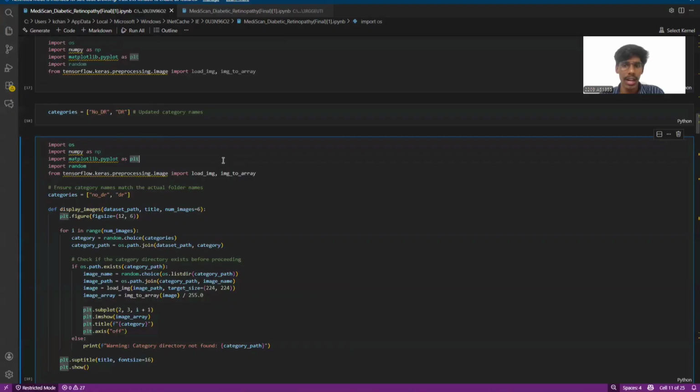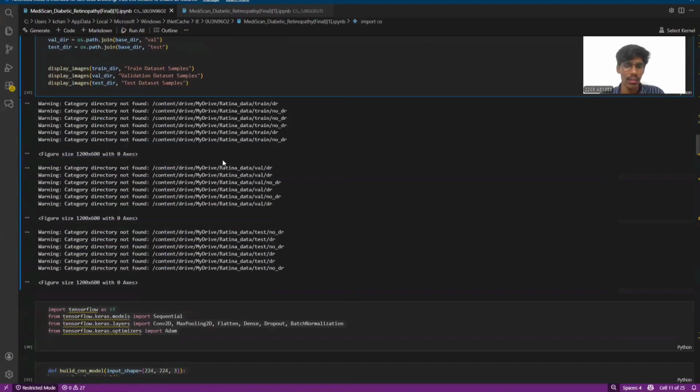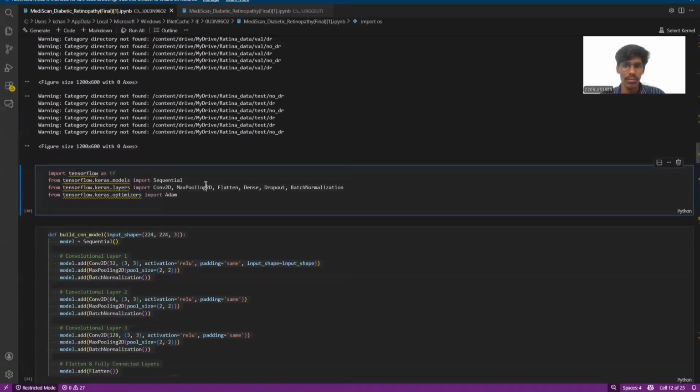Here, a function randomly selects, processes, and plots six images from your DR and no DR categories. It then executes this function for your training, validation, and test sets to provide a visual quality check of your dataset.